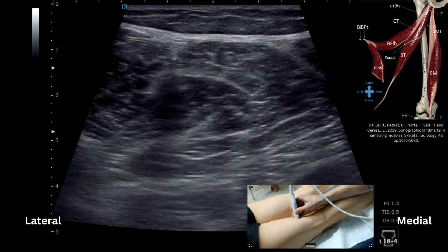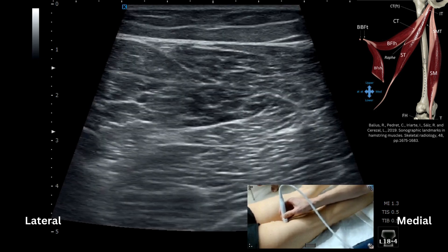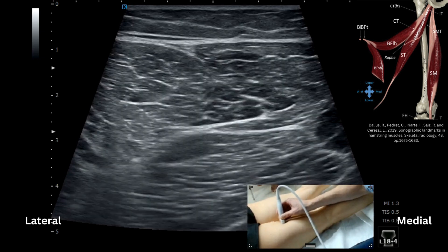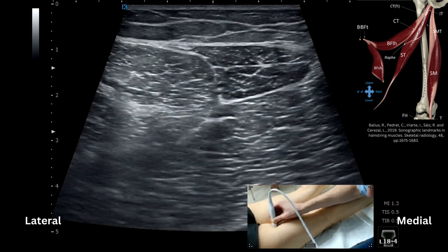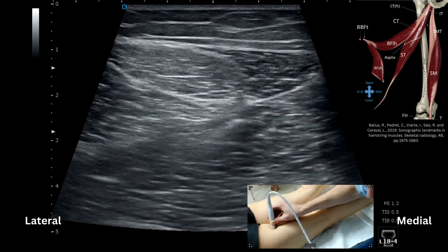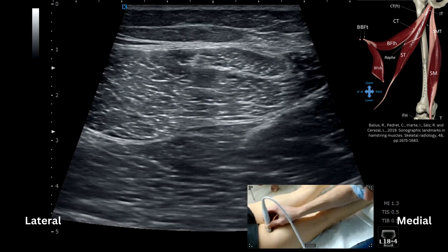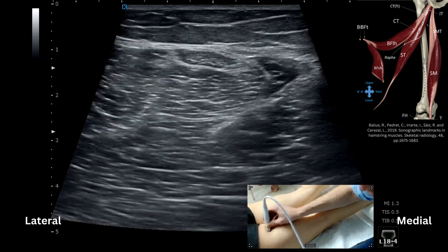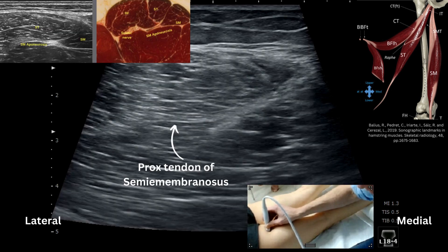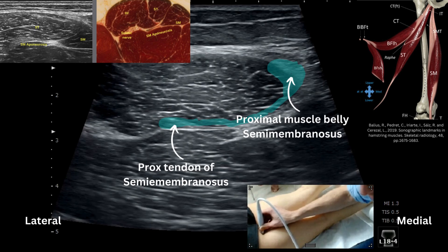Following semimembranosus up, I'm looking now for the formation of the aponeurosis of semimembranosus, which is sitting much more medial. This is the semimembranosus muscle, with the aponeurosis deep to the semitendinosus.